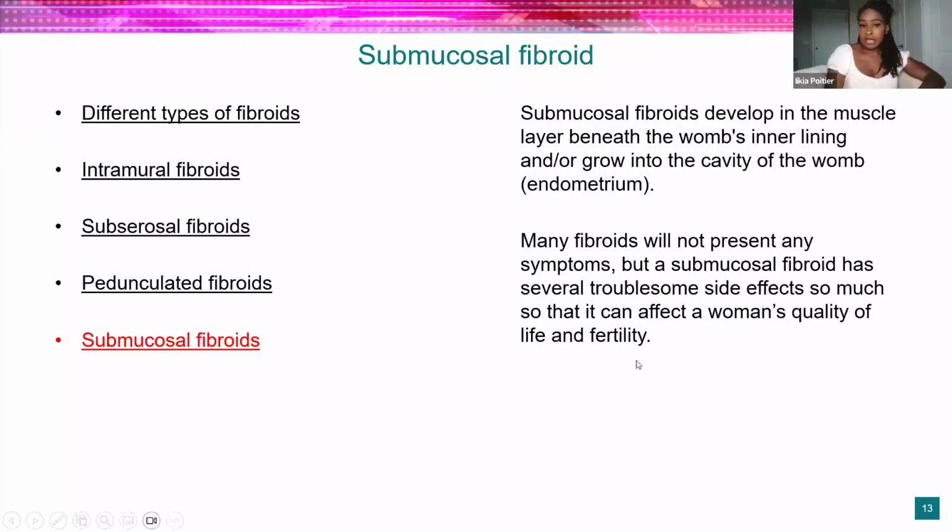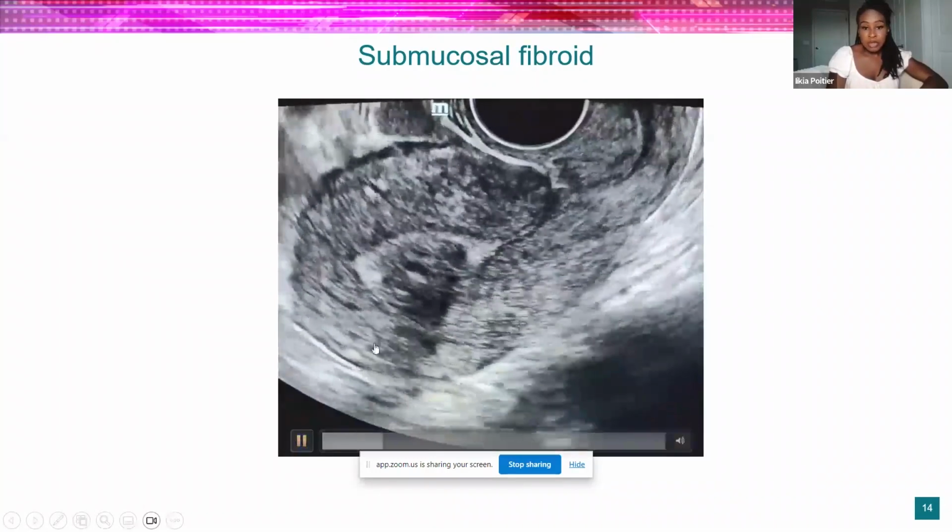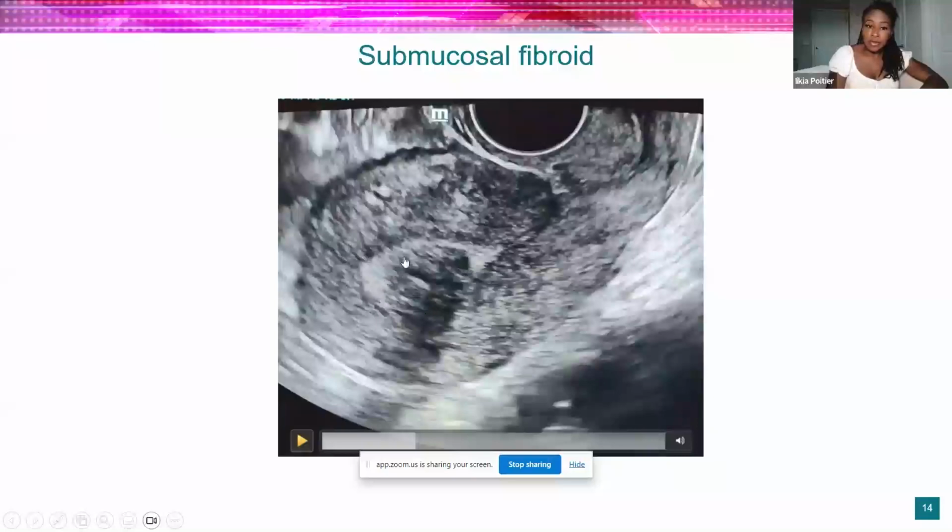So let's take a look here, see what I'm talking about. I got a video here. So before I start the video, I want you to see that this is the uterus right here. And you can see that right now, this is already a fibroid just lodged right in that lining. Right here, just circle. I can see a little shadowing here. I'm going to do some sweeps. Perfect picture there. You have the fibroid right there in the middle of the endometrium, which is this hyperechoic area here. It's just lodged right in that area.